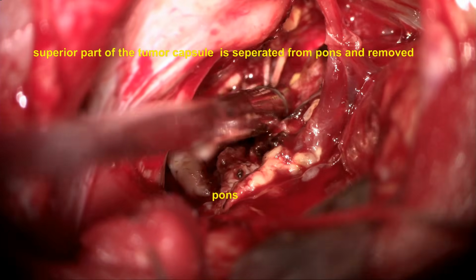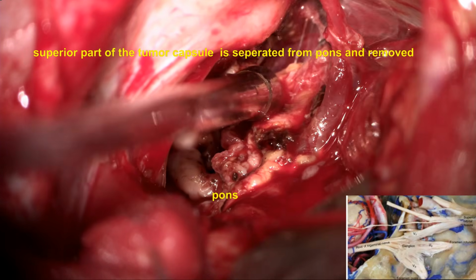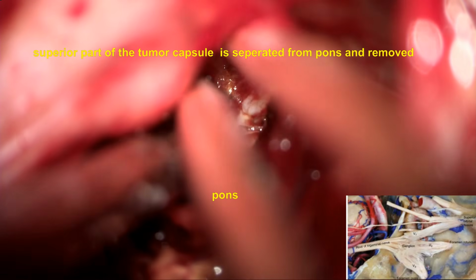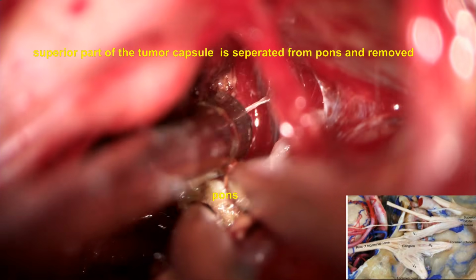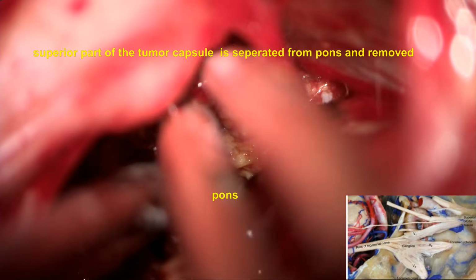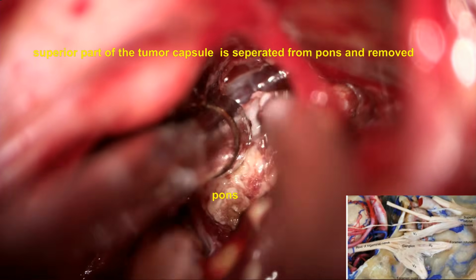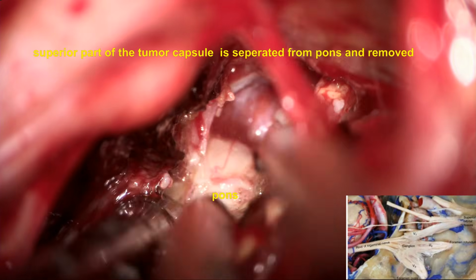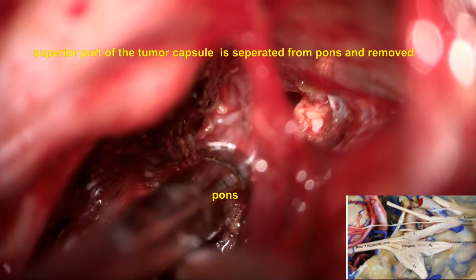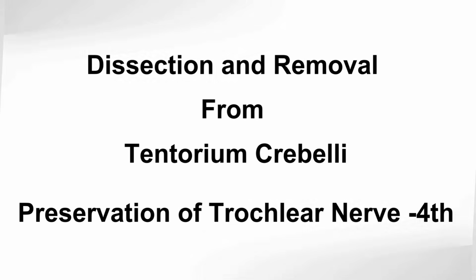At all this time, we need to keep watching for the deeper parts of the trigeminal nerve and keep looking for it, because now we are sure it is originating from the inferior part. The superior and middle part of the trigeminal nerve need to be visualized and preserved under any circumstances, especially the ophthalmic division. Now you can see the part of the tumor is being gently removed below the tentorium at the level of the trigeminal canal, and there is a good amount of arachnoidal plane which is preserved and removed.